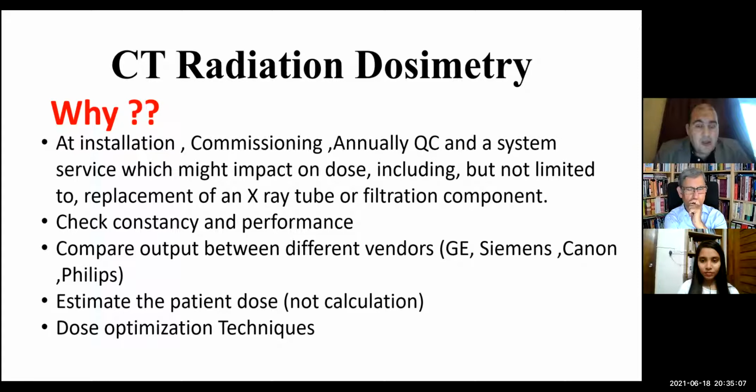Okay. And also it's important to learn CT radiation dosimetry to estimate the patient dose. Not calculation; we will learn today that a calculation of patient dose for CT is not accurate, but we are estimating the patient dose. And also, if you want to evaluate dose optimization techniques like dose modulation, kV modulation, milliampere modulation, or reconstruction algorithm, you also need to learn CT radiation dosimetry.